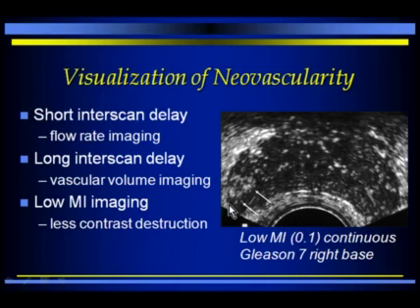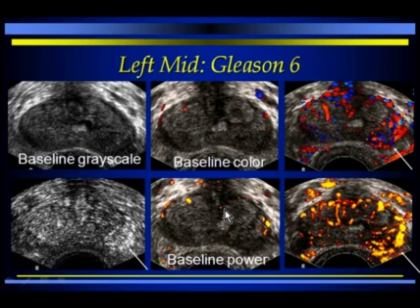And here's a nice example. This is the prostate. Here's your area of increased echogenicity. This is enhancement of a Gleason 7 tumor. Now remember we said you could have enhancement on grayscale, and here you see it. This is the baseline image where the cancer is not apparent. Here's the bright contrast enhancement on harmonic grayscale imaging.